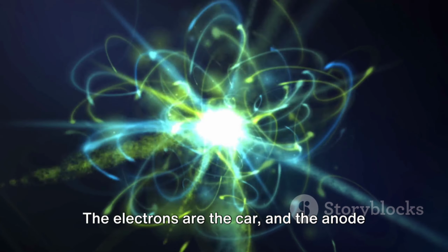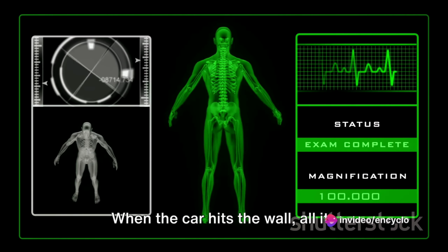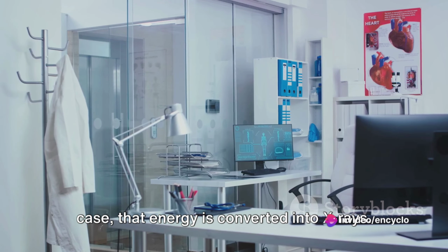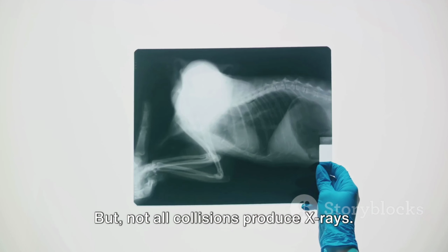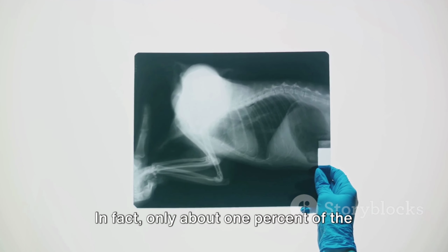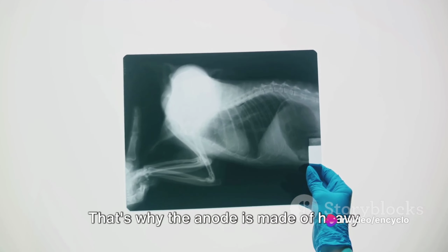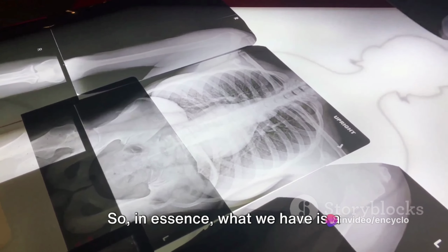Imagine it like a car crash. The electrons are the car, and the anode is a brick wall. When the car hits the wall, all its energy has to go somewhere, right? In this case, that energy is converted into X-rays. But not all collisions produce X-rays. In fact, only about 1% of the collisions result in X-rays. The rest is released as heat. That's why the anode is made of heavy metal like tungsten, which can withstand high temperatures.